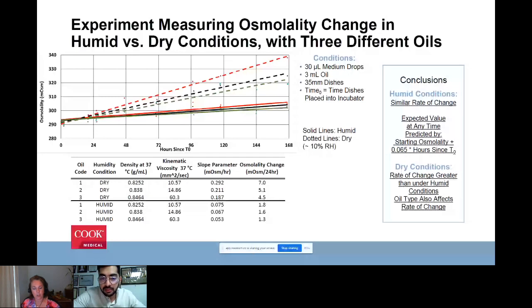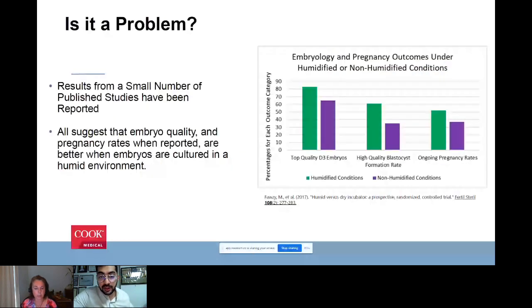Because we've seen in our laboratory as well, there are times where you would get a good blastocyst on the end of day 4, like a fully expanded blastocyst on the end of day 4. And then we are worried whether it's cleaving faster than normal, is it genetically normal or not? There are lots of questions which happen there.